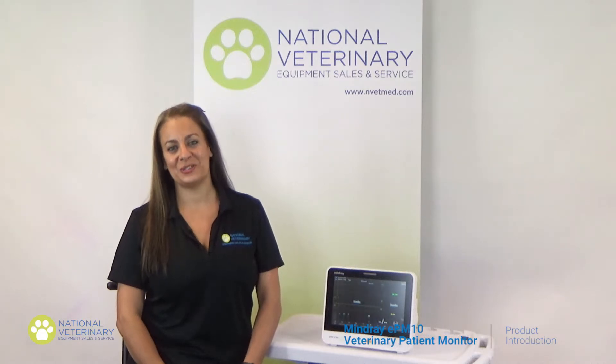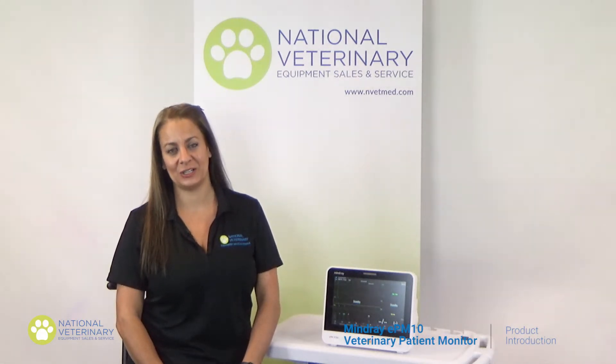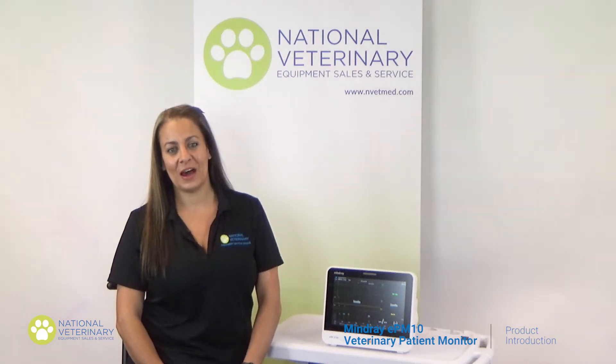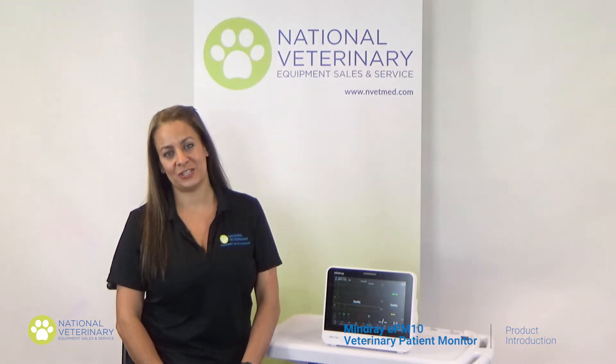Hello, and thank you for joining me today to learn about MindRay's new generation veterinary monitor, the EPM10 Vet. My name is Ashley, and I've been a vet tech for more than 25 years. In this video, I will cover the multiple ways this monitor showcases its intelligence and elevates patient safety.